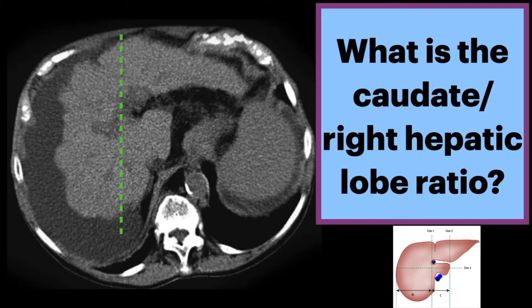Our first line is drawn through the right lateral border of the portal vein. Our second line is drawn through the left lateral border of the caudate lobe. Line number three is orthogonal to lines one and two, midway between the portal vein and the IVC extending to the right liver edge.